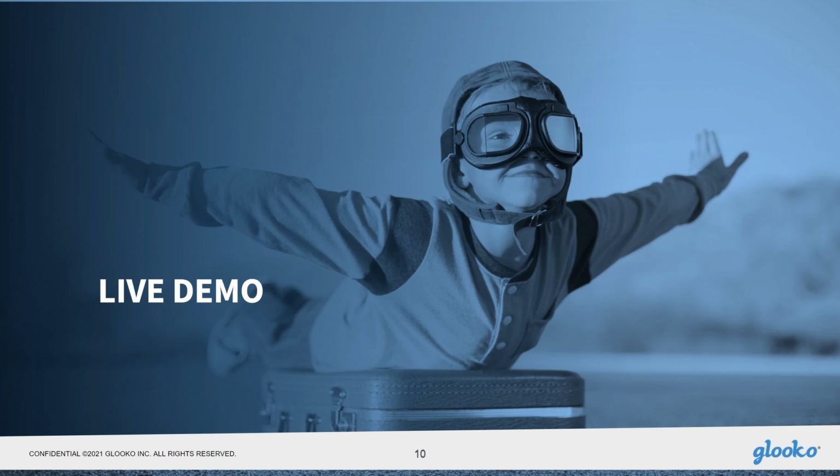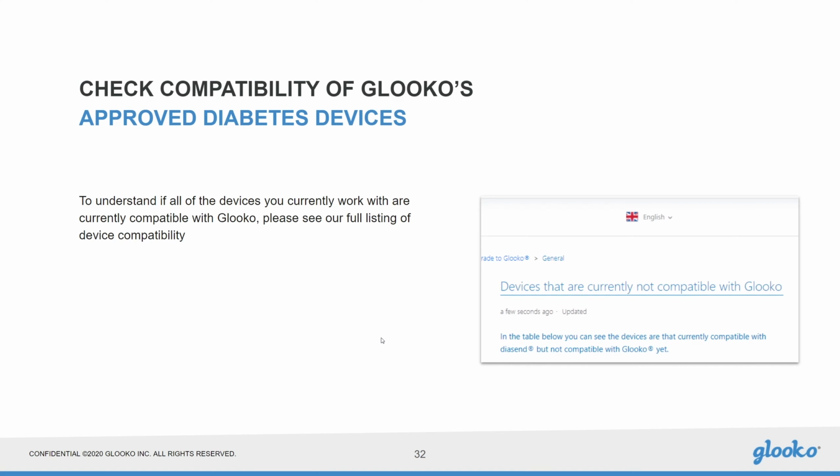Hopefully you found the live demonstration useful. I'm sure you'll agree there's some fantastic reports there that are going to provide a lot of value for consultations moving forwards. Before making the transition to the Glooko platform from Diasend, please do check that all of the devices that you are frequently using within clinic are compatible with Glooko.